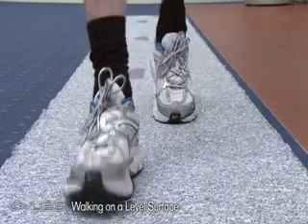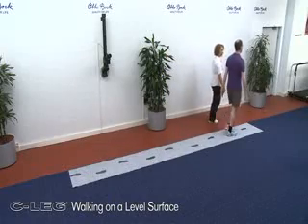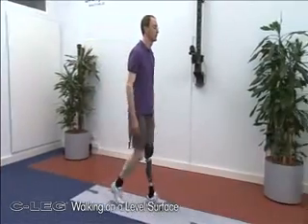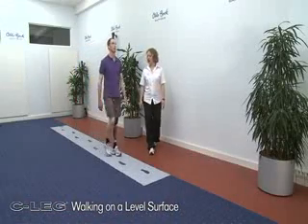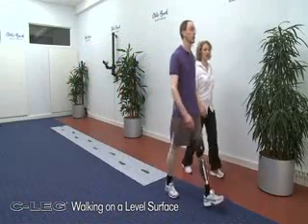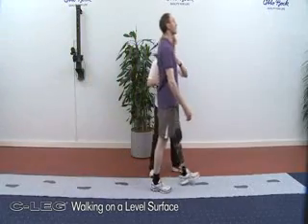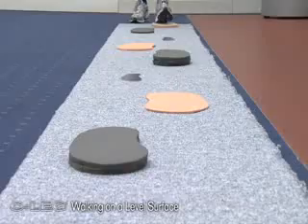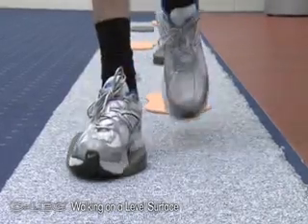The amputee tries to step on the footprints. In doing so, hitting the target by drawing up the contralateral heel must be avoided. The patient should not focus on the footprints for too long during this exercise and should keep the upper body upright and the gaze straight ahead while walking. This exercise can be completed between parallel bars and later also during unsupported walking.